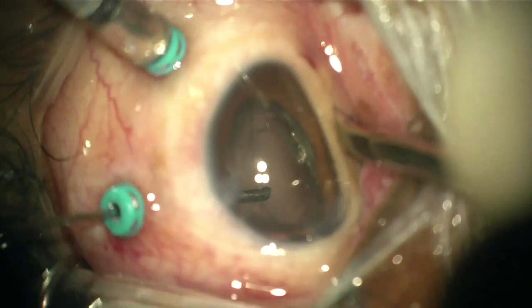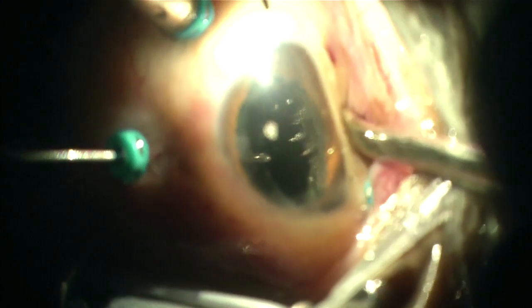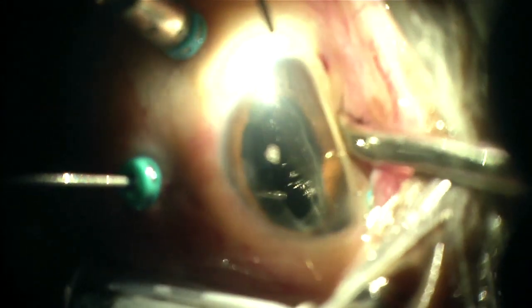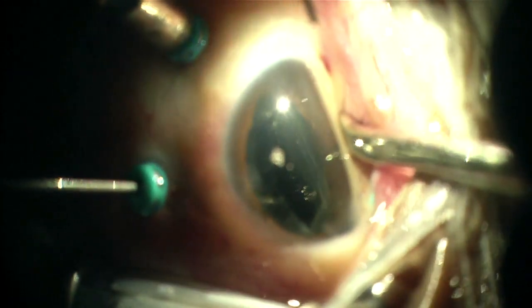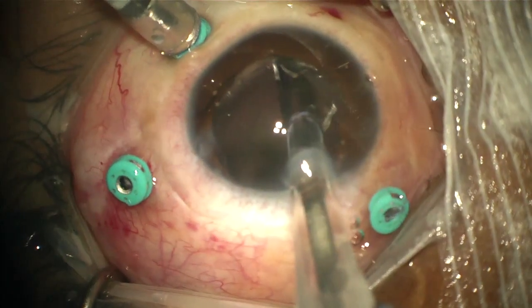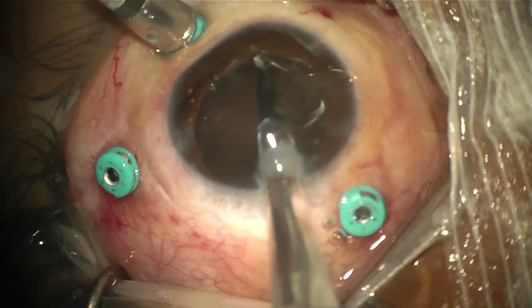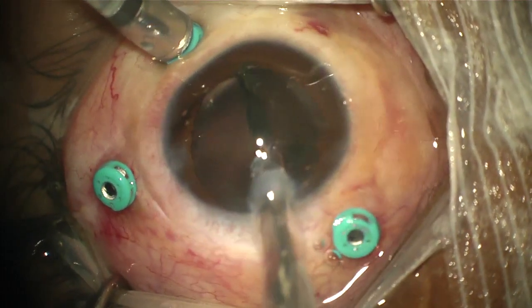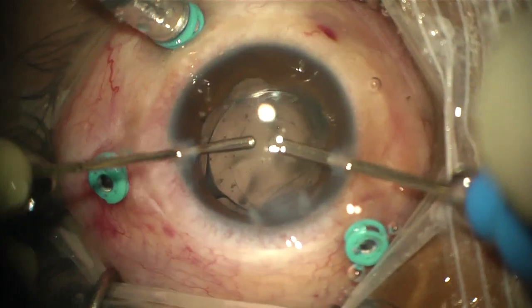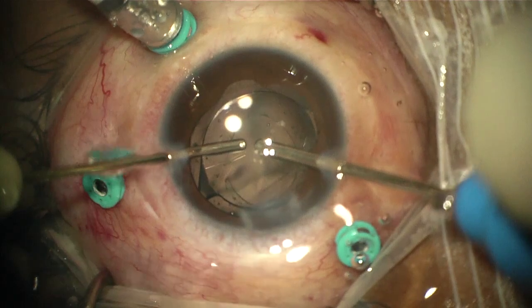The final step is to look at the periphery — here I found some droplets, some of which may be silicone oil. Finally, a one-piece intraocular lens is placed inside the bag, followed by bimanual irrigation-aspiration, wound hydration, and trocar removal. Thank you so much for watching.